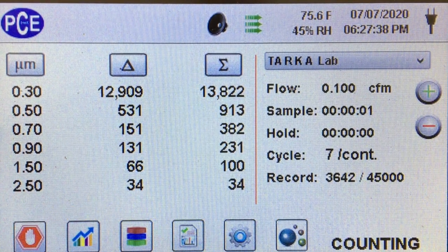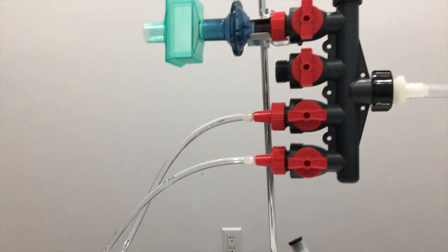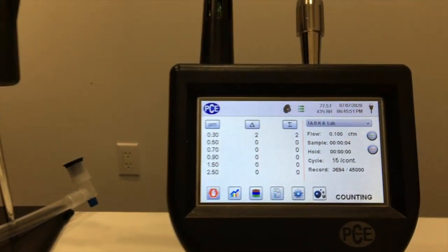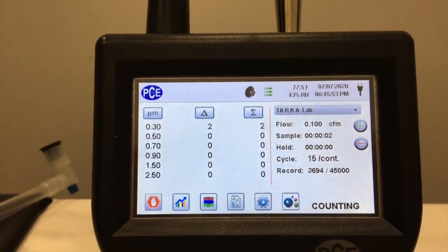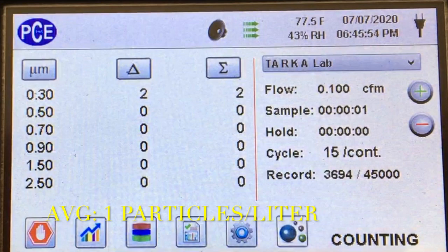Next we change the setup so that we can measure the particles through the mask. You can see the air is going through the mask, through the forehead and through the mouth portal, through the manifold and into the particle counter. The particle counter is very, very low as far as the number of particles coming through, and our average was one particle per liter.